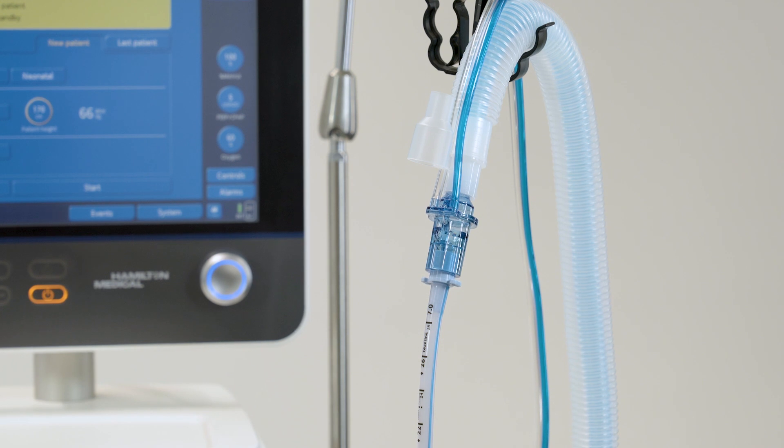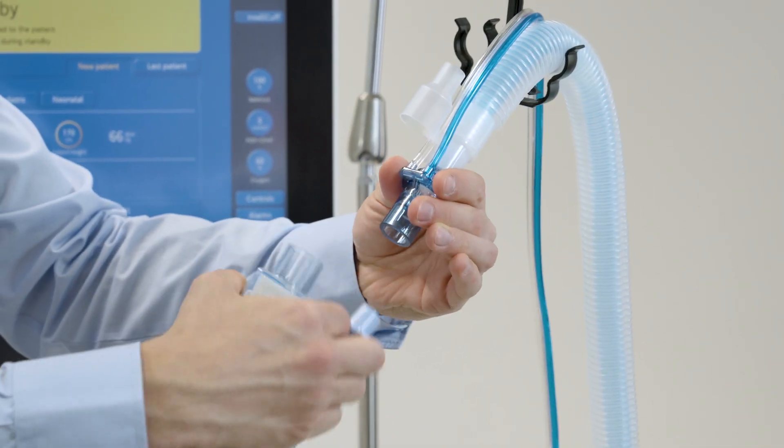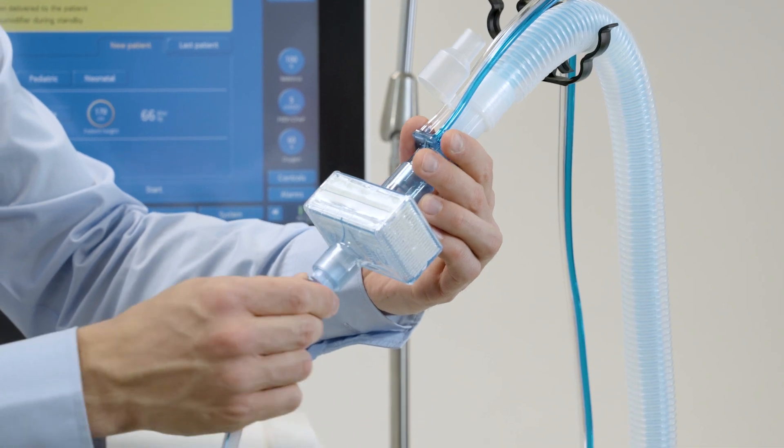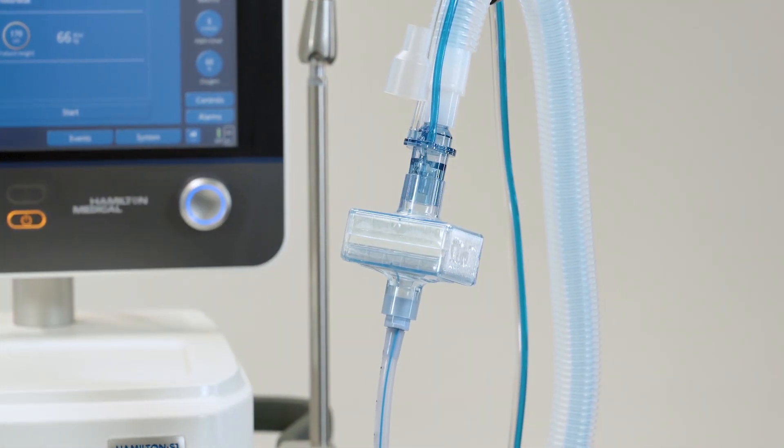If you are using a coaxial breathing circuit, perform the tightness test and flow sensor calibration before connecting an HME filter. Once the flow sensor calibration has been completed, place an HME filter between the patient and the flow sensor.